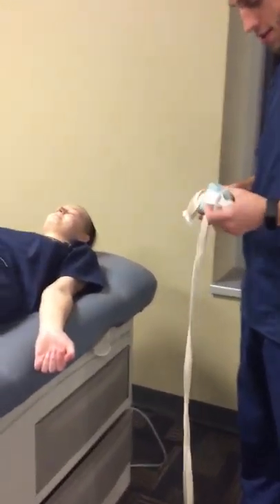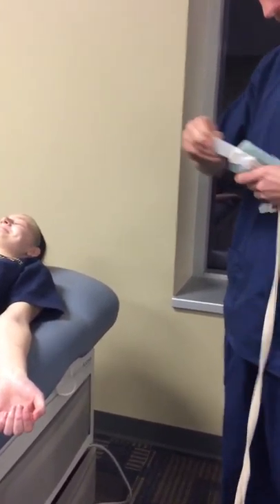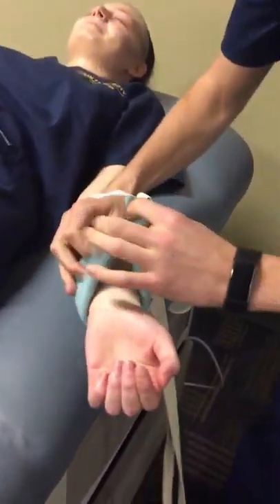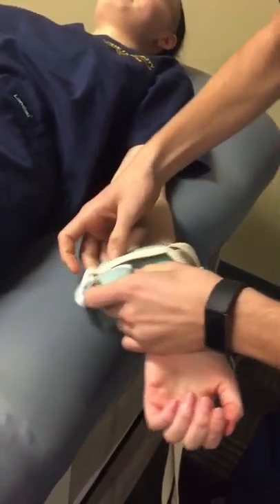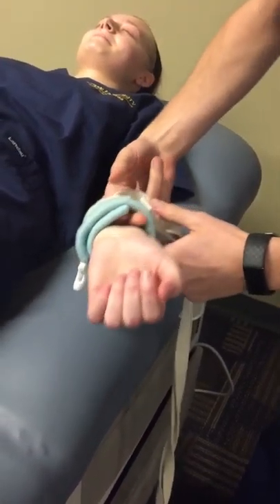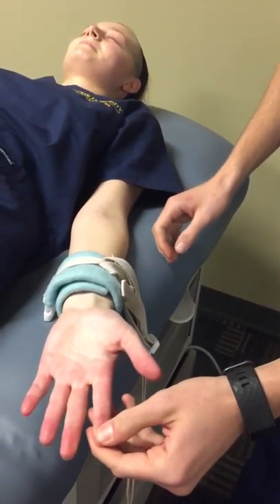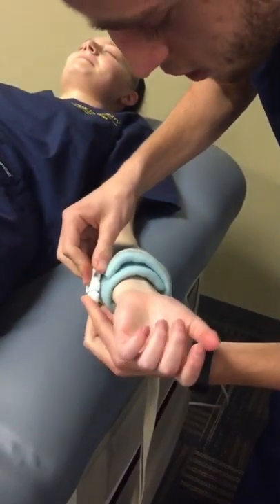When applying wrist restraints, it is important to make sure that the wrist restraints are tight but not too tight — you want to try to fit about two fingers underneath them. Then you want to check for a capillary refill to ensure blood flow is still able to flow through the restraints.